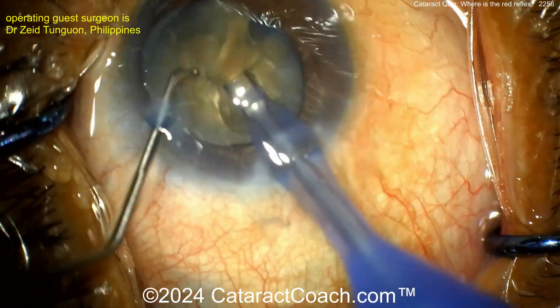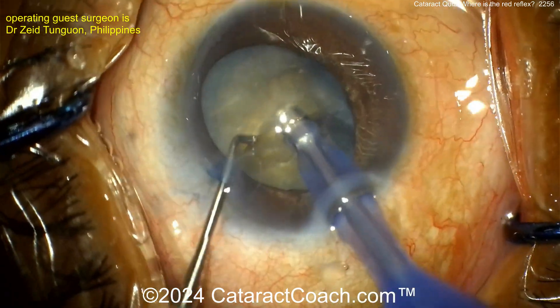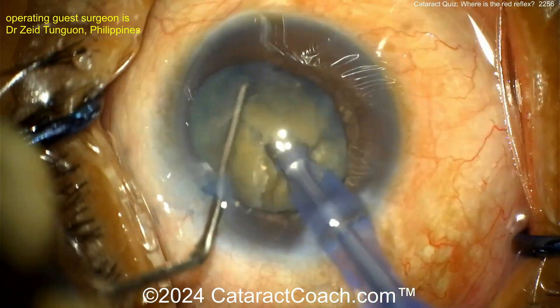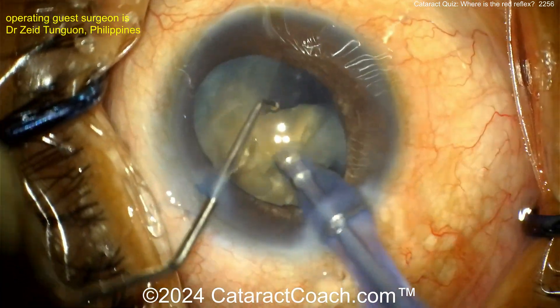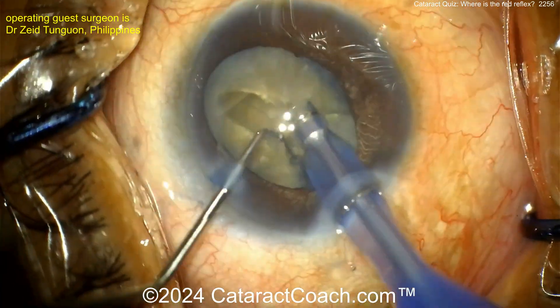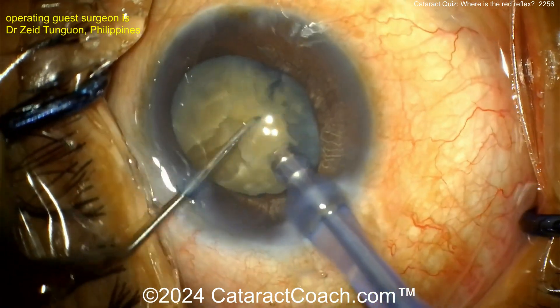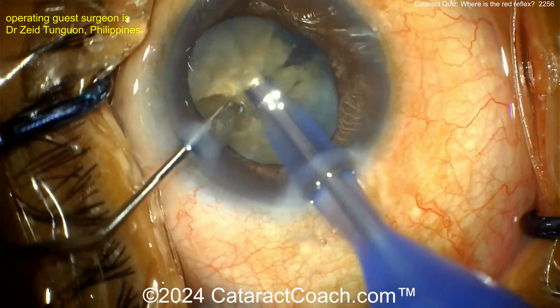As you empty the bag, since you have the trypan blue dye that went into the vitreous cavity, there is going to be some zonular weakness — you have to be very careful. As you get these pieces out, there's going to be no red reflex again, and now you know the reason why.